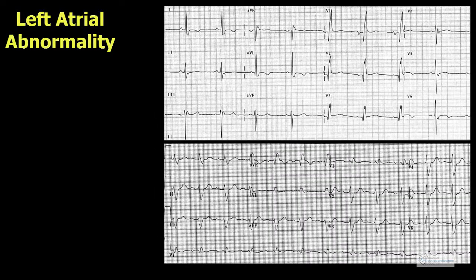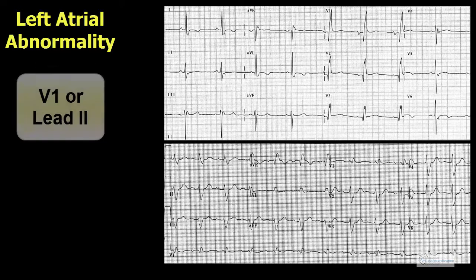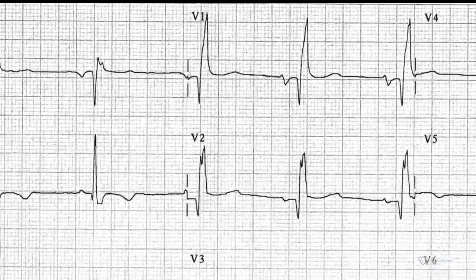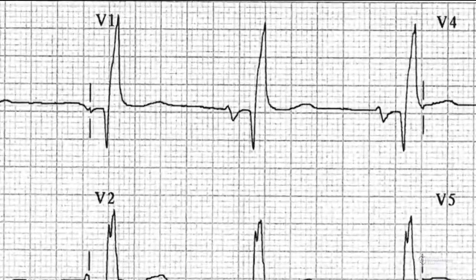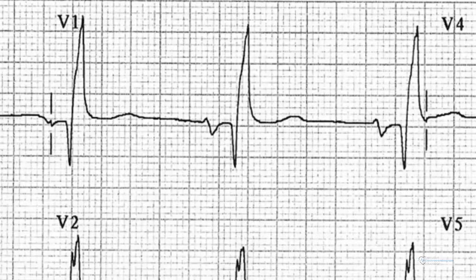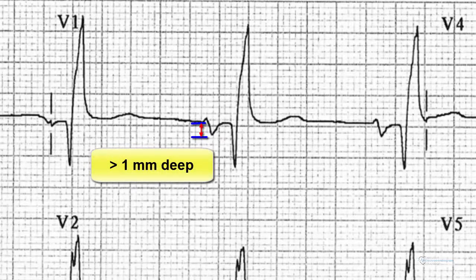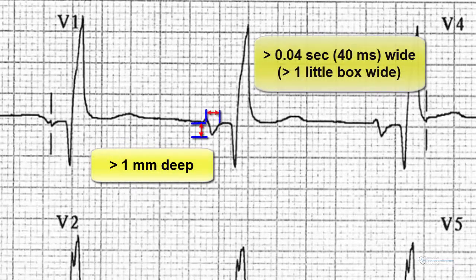In this set of electrocardiograms, we will be looking at left atrial abnormality. To determine left atrial abnormality, we simply look at leads V1 or lead 2. In V1, as in this electrocardiogram, the P wave may be greater than one little box deep and one little box wide.